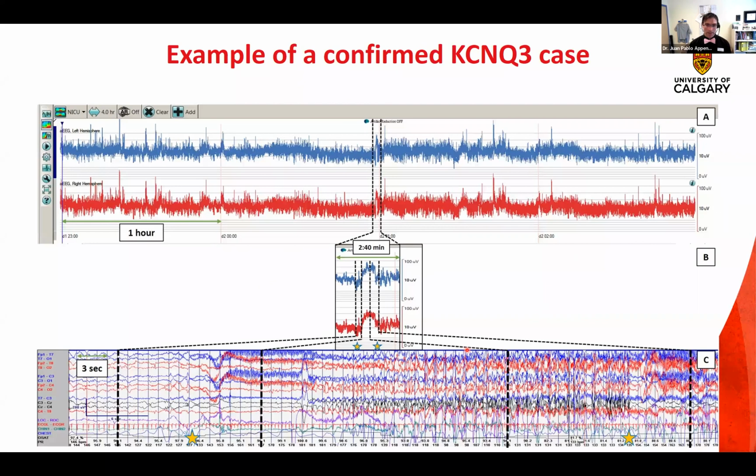And why is that? Because the seizure starts around here with diffuse attenuation, which leads to the decrease of the lower margin, and then gradual buildup of the amplitude with tonic-clonic activity, which leads to the upward deflection of the aEEG, and this one you can see in real time. And then, gradually, you don't see it here, but there is a diffuse attenuation post-ictally, which is a suppression. So we have desynchronization, attenuation, tonic-clonic or rhythmic activity, followed by diffuse attenuation, post-ictal suppression.